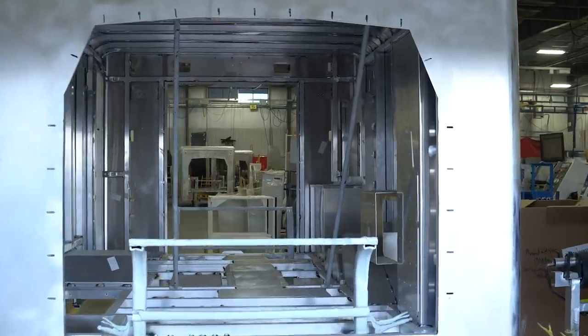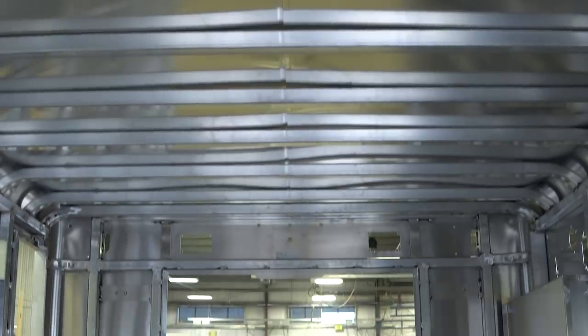Behind me I have the CCL 150 by Crestline. This ambulance is defined by three main factors: safety, durability, and value. It has an extruded aluminum frame, which keeps the patient and the provider safe in the event of a crash. It also has a lifetime structural and paint warranty, as well as a multiplex electrical system. Today we're going to go through the outside of the ambulance, the inside, and look at all the features Crestline has included in this rig.